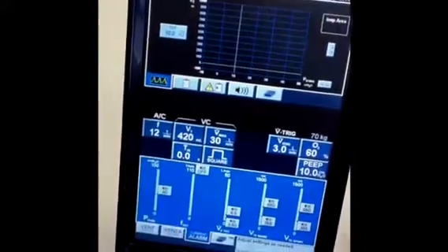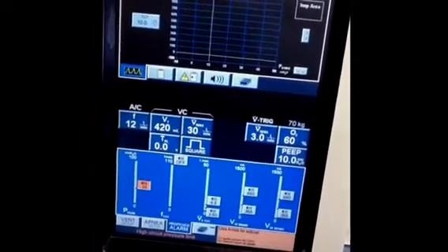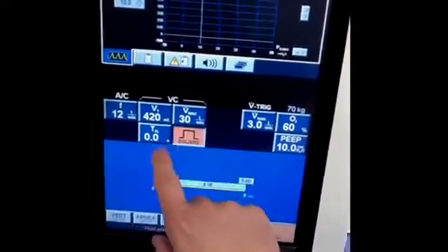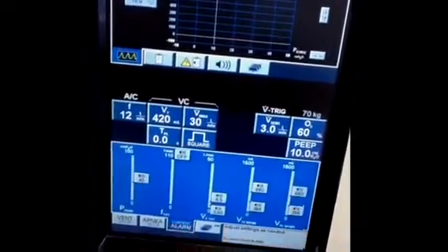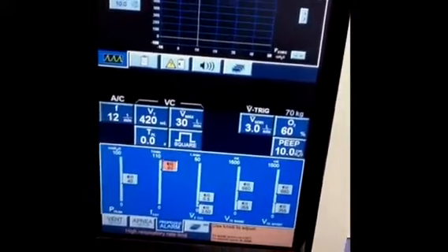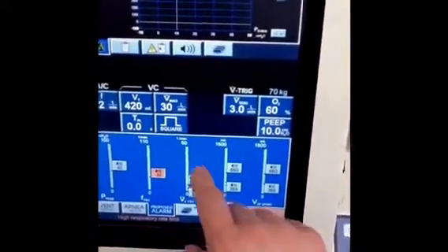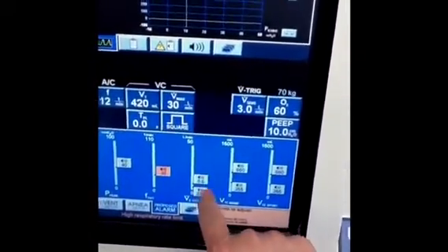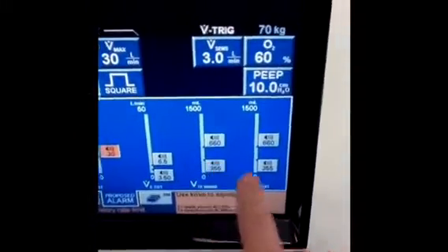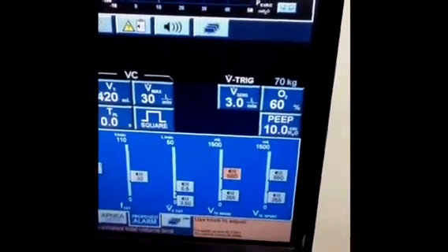The last tab to select includes the alarm settings. In the sandbox, alarm settings come up from left to right. First, you have the high peak pressure alarm. To the right of that is the high frequency or rate alarm. Next is the high and low minute ventilation alarm. And the last two on the right are the tidal volume alarms.